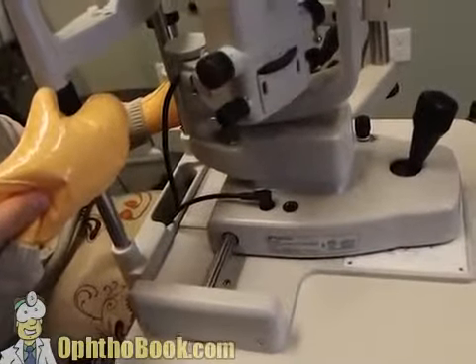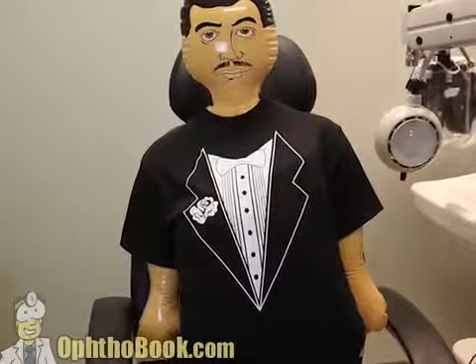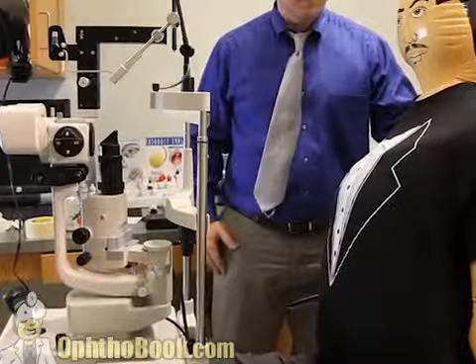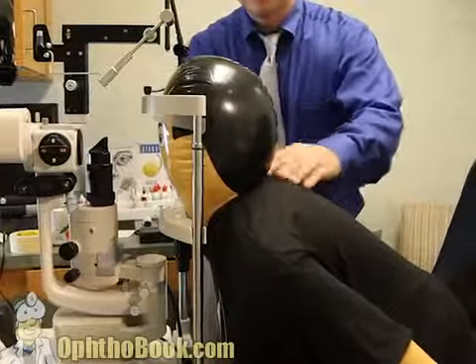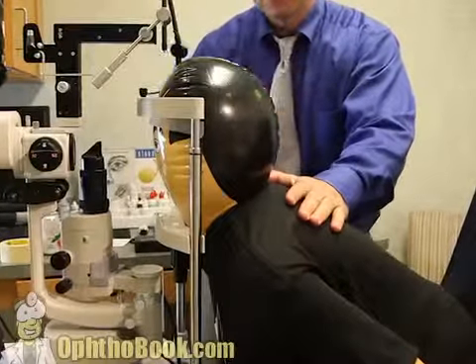The patient can grab onto the side of the table or the side of the microscope here. Occasionally you'll have a chubby patient with a very large abdomen, very hard to get up to the microscope, and I find it helpful to make the microscope very low and far away for them so they can rotate down and into it. And you'll notice here that I'm pushing on the back. I'm not pushing on the head here. It's a lot safer to push on the middle of the back. You'll get better chin position and it's just safer.